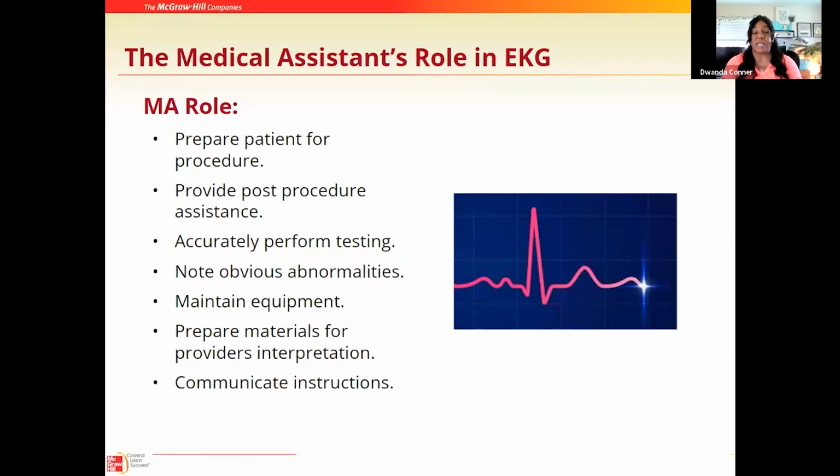So the medical assistant does have a vital role in assisting and actually conducting the EKG testing. The MA role, first, we're going to prepare our patient for the procedure. Now with this, if they haven't had an EKG done before, you might want to give them information as to what to expect. This test is non-invasive. It doesn't cause any pain or any discomfort to the patient. So we would make sure that we answer all of those questions before we proceed.